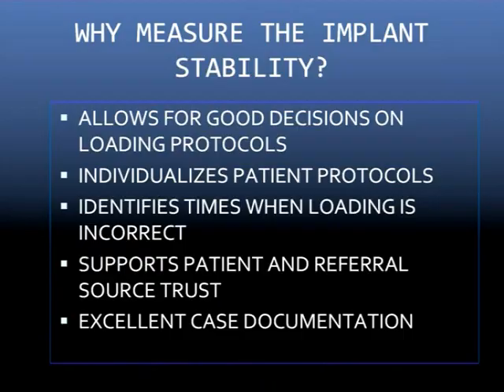The second thing I want to point out is, why do we measure implant stability? Well, it allows us to make good decisions regarding loading protocols. It also individualizes patient protocols. Not every patient, not every situation is the same. It identifies times when loading is incorrect, which is also a practice builder and saves a great deal economically. You support the patient and the referral source with the reassurance that everything is going well. And it gives you excellent case documentation in your own practice as to what and how things are happening.